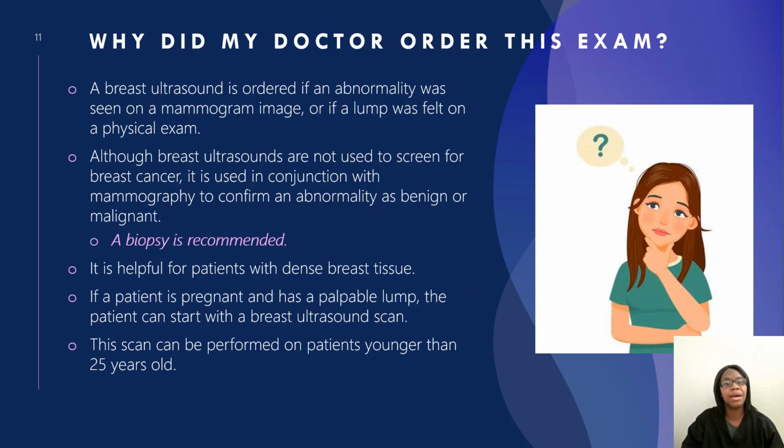Now we're going to talk about why the doctor ordered a breast ultrasound scan. I always like to verify this with the patient because sometimes they come in and they don't know why the doctor ordered it. So a breast ultrasound scan may be ordered if an abnormality was seen on a mammogram image, on a previous breast ultrasound scan, or if a lump was felt.